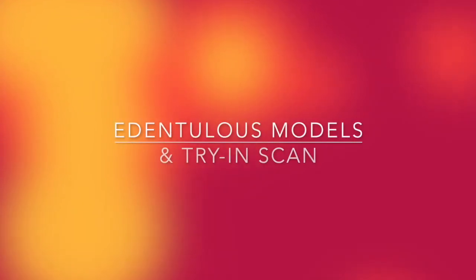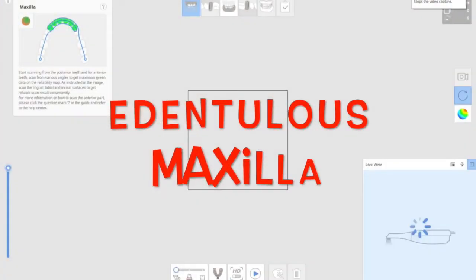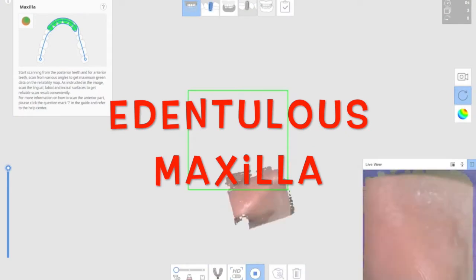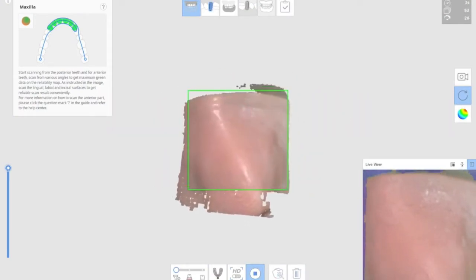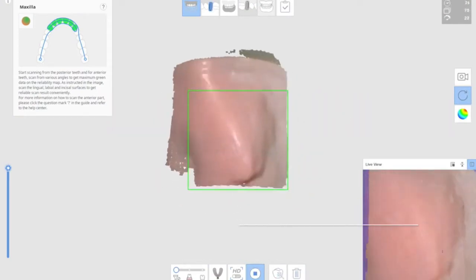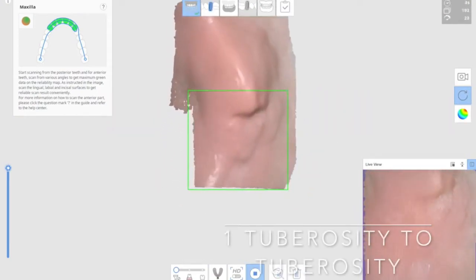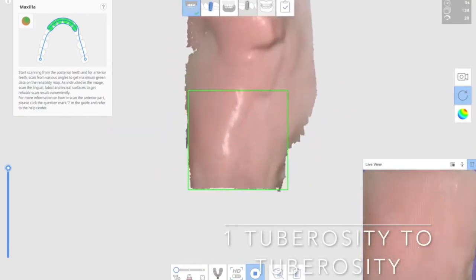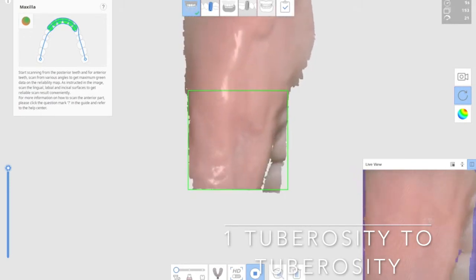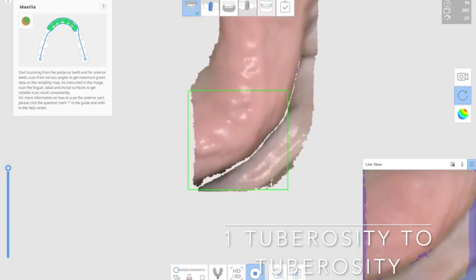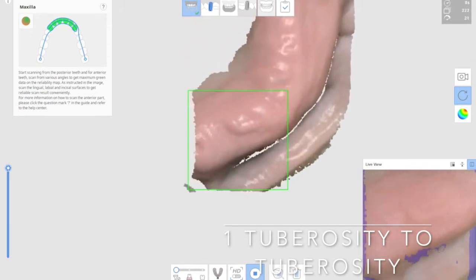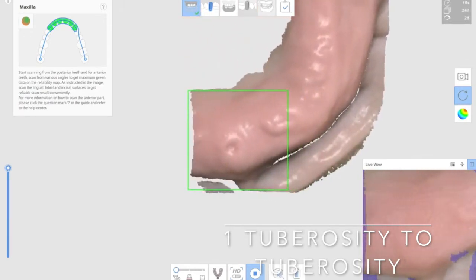I'm going to talk about edentulous model scanning. For the maxilla, we're going to start from tuberosity to the other side of tuberosity, scanning the arch first.